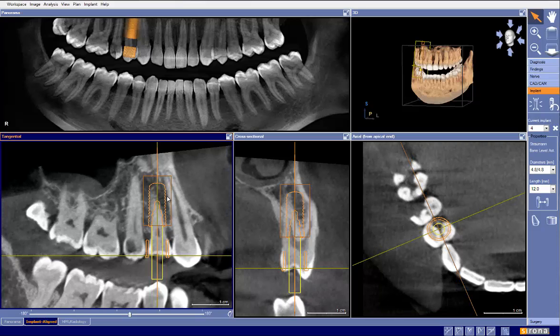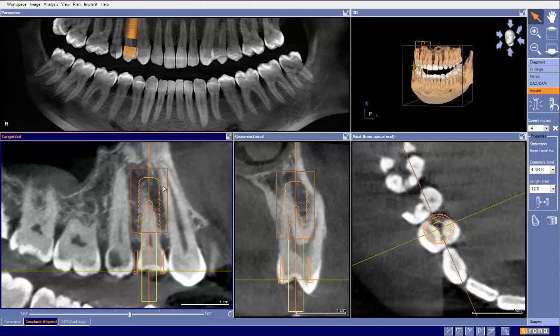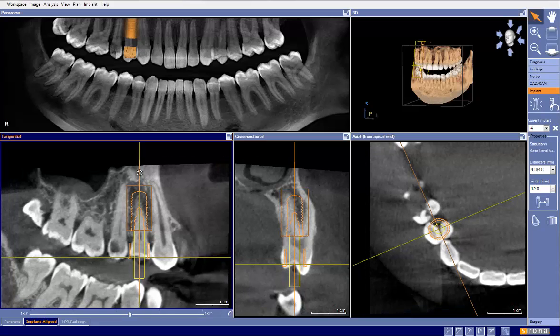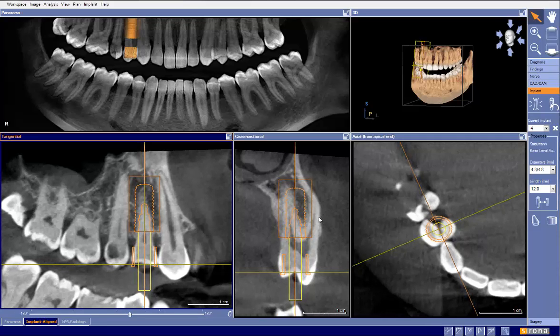And in doing that, what we do notice, and very common in this particular area, is that we come into problems with these teeth. So this is an area where we know we're going to have to make a little bit of a compromise on the occlusal plane. But again, we're more than happy to do that in this particular case for a single tooth like so.